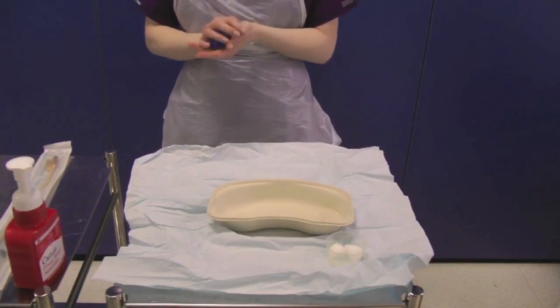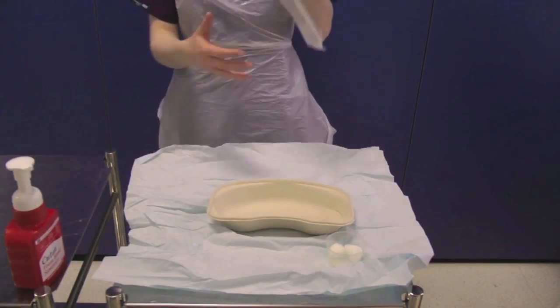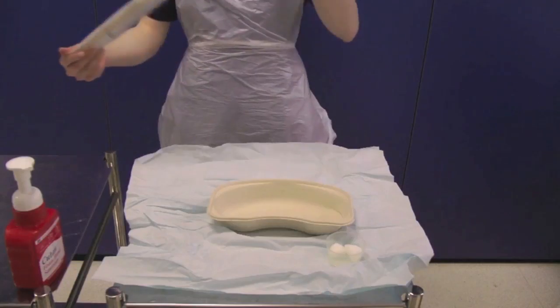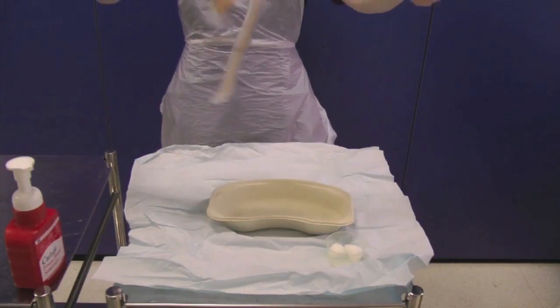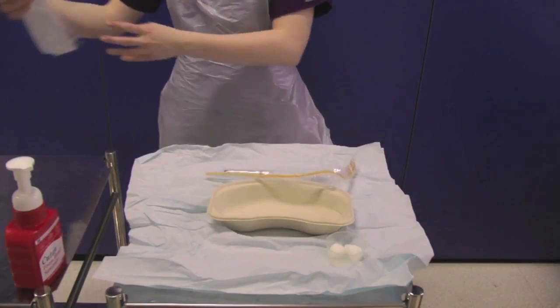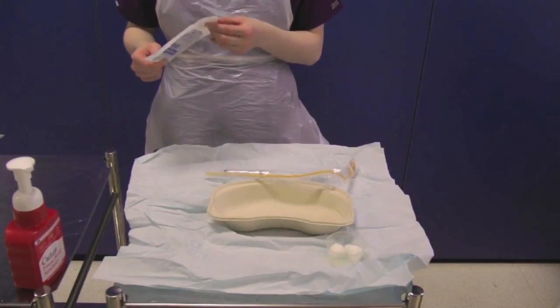Remove your gloves and decontaminate your hands. Take the selected catheter, ensuring you have the correct size. Check the expiry date and note the stickers on the catheter pack that must be saved for use in the notes later. You can use both a standard size and a female size catheter in women. In this video we use a standard size catheter. Open the outer packaging and carefully drop the catheter and syringe onto the sterile field. Be very careful not to touch the sterile field with the non-sterile outer catheter packaging.